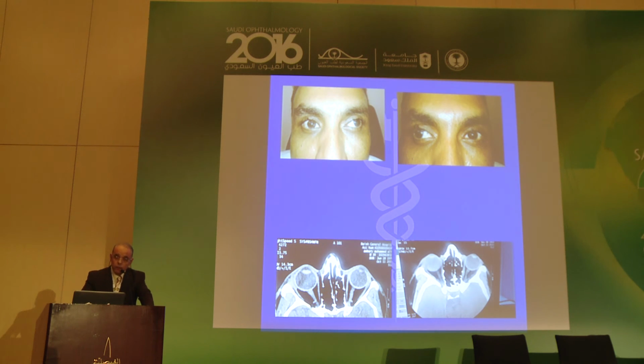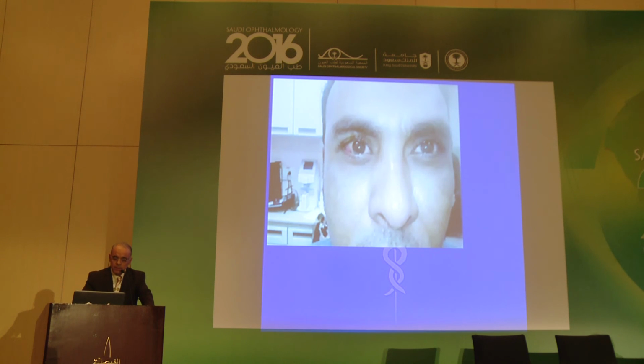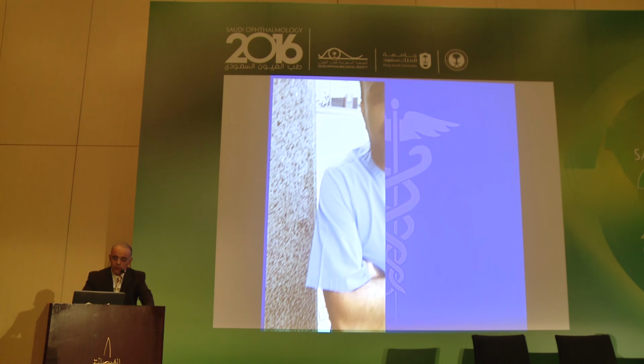One day I had to reoperate on a patient whom I had done. I found the muscle reinserted with fibrotic tissue. And I do myectomy to it and make a suture fixation for him. This is after operation. This is the CD if you want to see after 6 months.